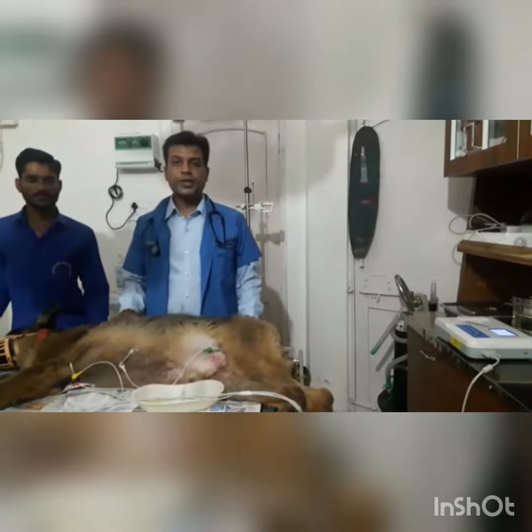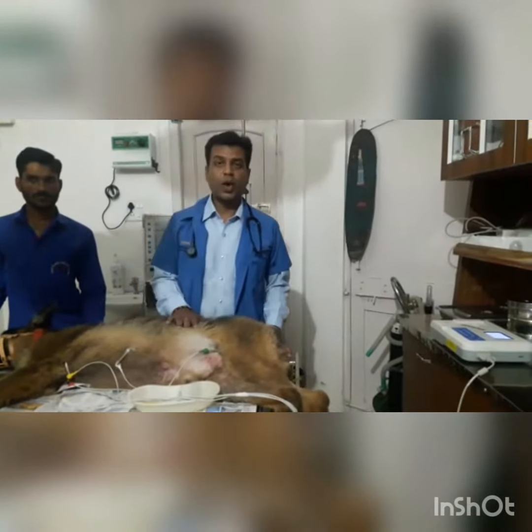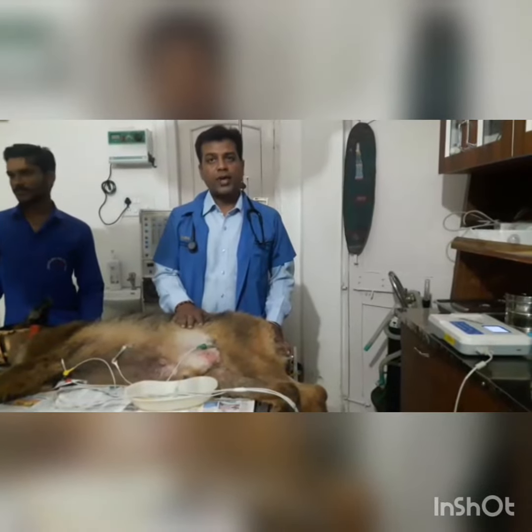There is a German Shepherd dog, Guzo. He is suffering from ascites — fluid floating in the abdominal cavity — which we have diagnosed via radiography.